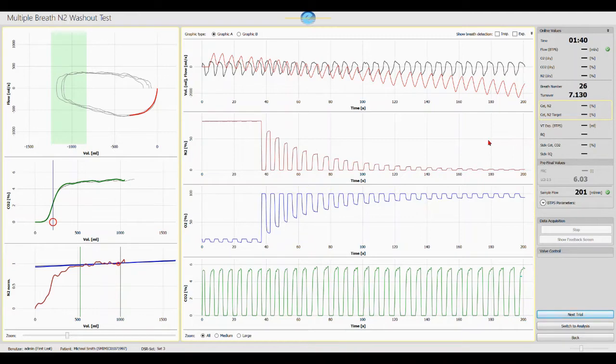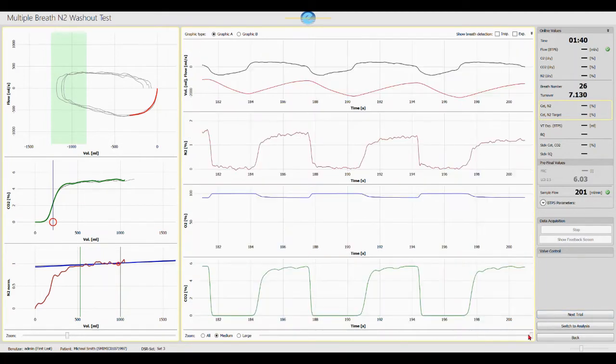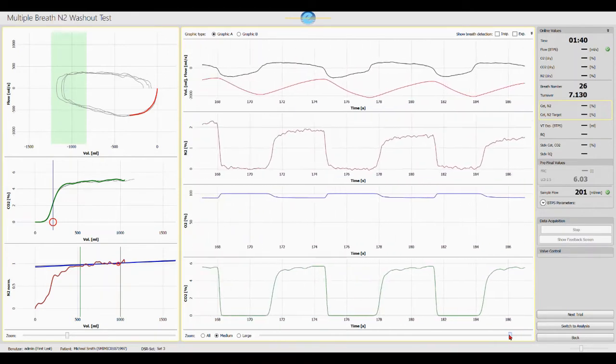During the washout, several quality parameters are monitored by the software and significant irregularities will be signaled by a warning message. After the trial, the operator can scroll through the washout again to check flow, volume and gas concentrations in detail.